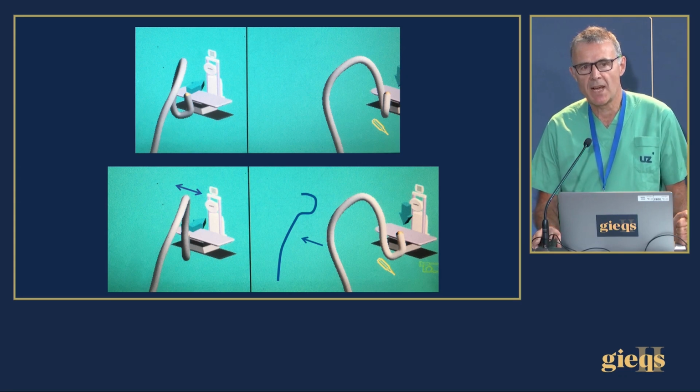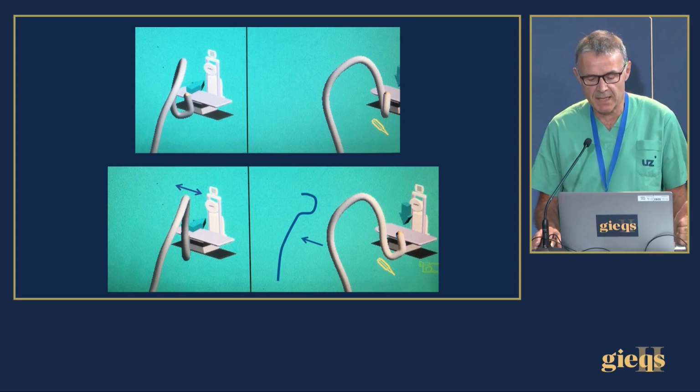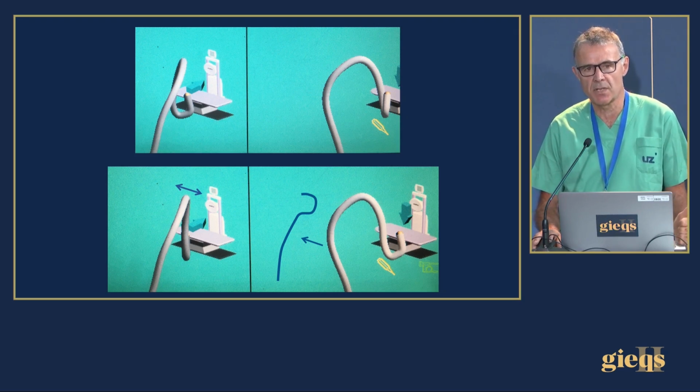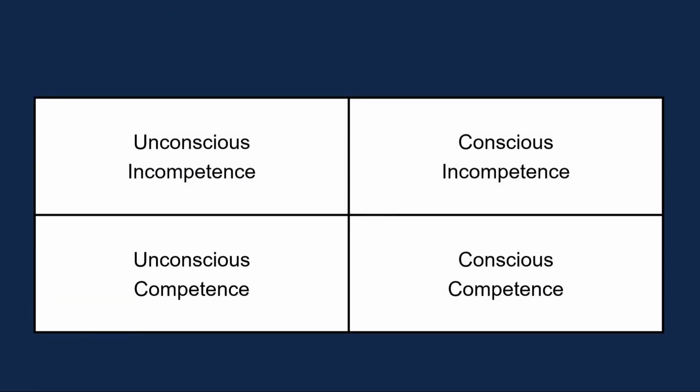But one thing that will happen as you've resolved the loop is the configuration will look like that 9 times out of 10. And the bit below the angulation, there's a lot of colon pleated onto the scope there. There's a lot of weight on the scope. And I know that this is a very unstable position and I have to do everything slowly. So I know all these things and I can explain them, I can deconstruct them. So that's conscious competence.